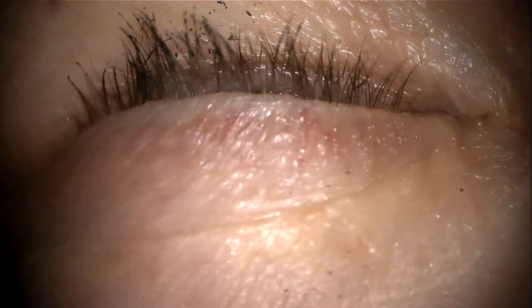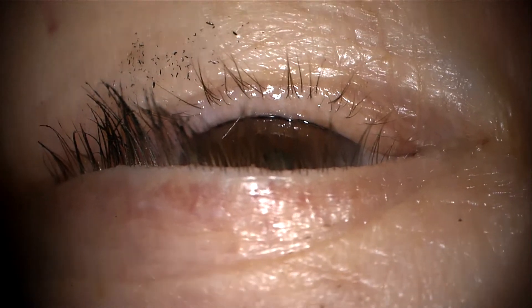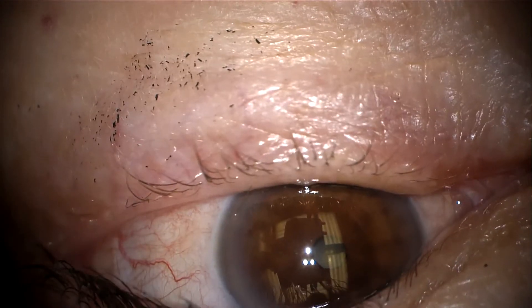Electrolysis or epilation of malpositioned eyelashes, such as in trichiasis or distichiasis, is a very commonly performed procedure. Note that trichiasis and distichiasis are two different entities.